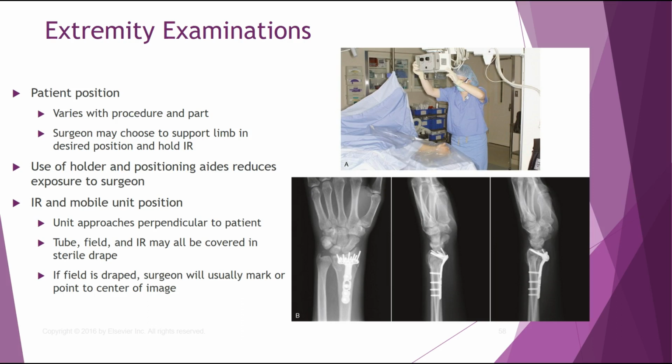You're just going to need to make sure you can change your technique, okay, accordingly. Use a holder if you need to, if possible, okay? And then everything else is, the field's going to be draped. The surgeon will usually mark or point to the center of the image that he wants you to be taking a picture of. And once again, try to remember you want all of the hardware.